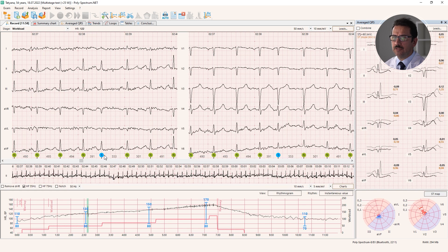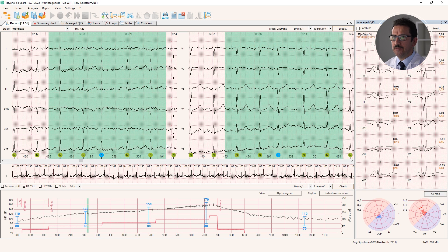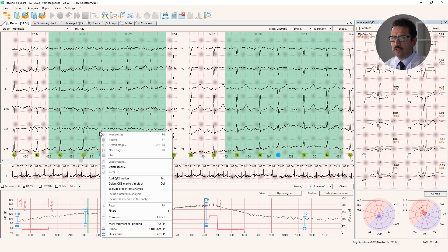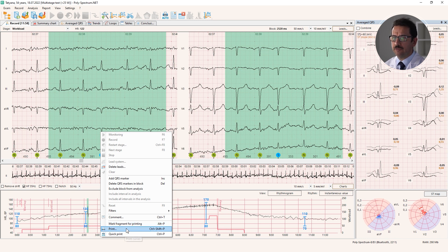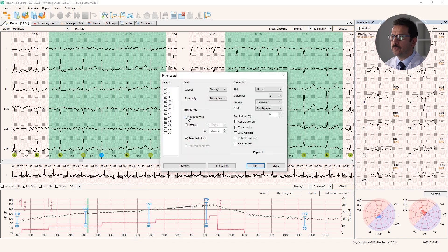Yes, I can see that this is a supraventricular extrasystole. The software detected it and marked it differently by color and the QRS complex name 'supraventricular'. In case this information is important and I want to include it in the report, I have an option to select the ECG, right mouse click, and select mark for printing — to print afterwards or include in the report.